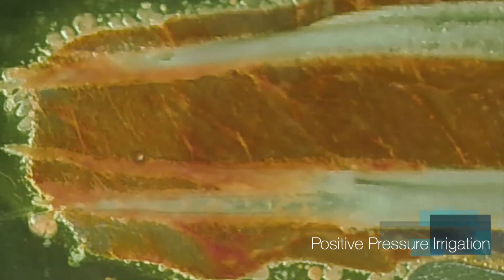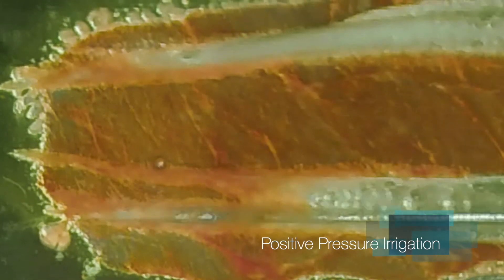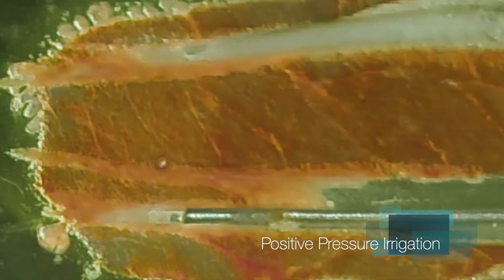Rotary debridement in the lower canal. Suddenly, we have room for the positive pressure irrigation needle, so it can get in there and get the job done.